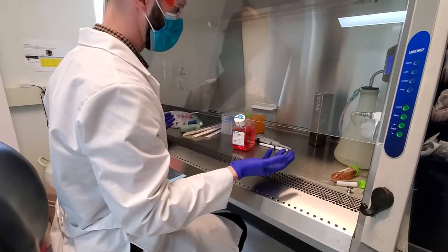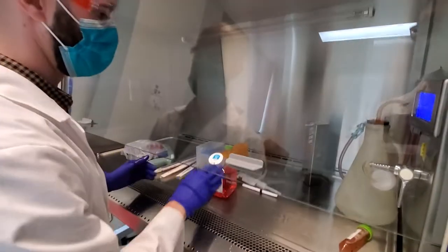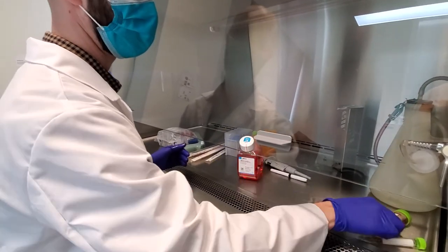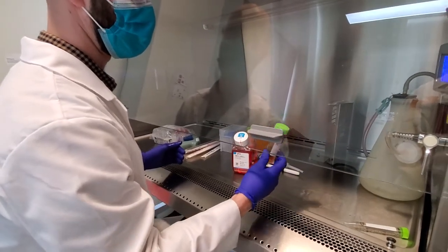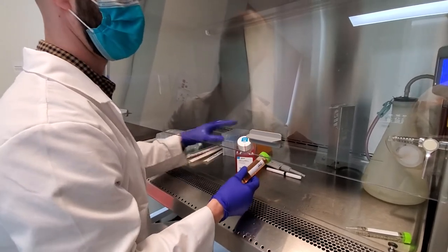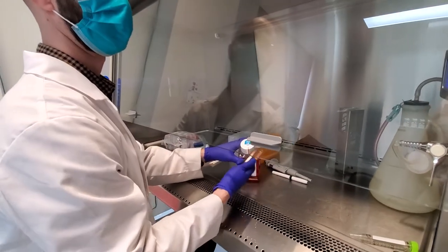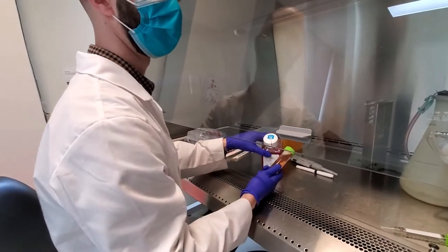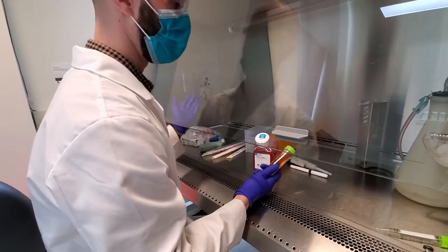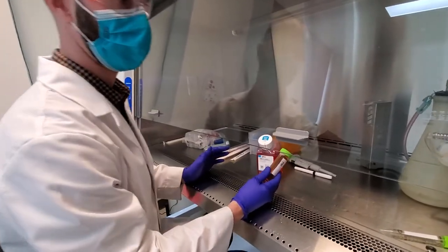So typical cell culture media is 10% FBS. This is 500 mLs of media, so it should be 50 mLs of FBS. Some people do a true 10% and draw 50 mLs out here, so that when they add the FBS in, it's actually 10% of the total solution. I just add it straight in. I find it doesn't make a difference, and then you have a little bit more media.